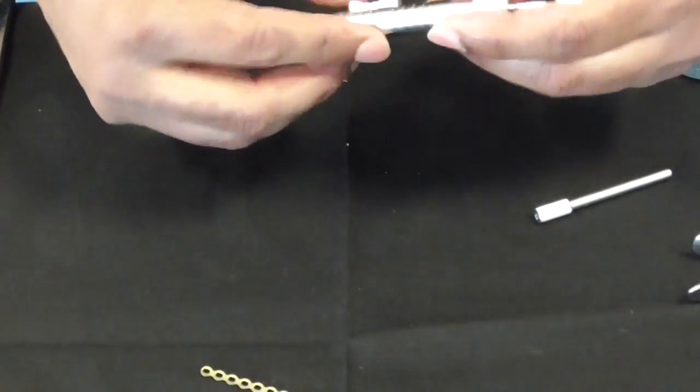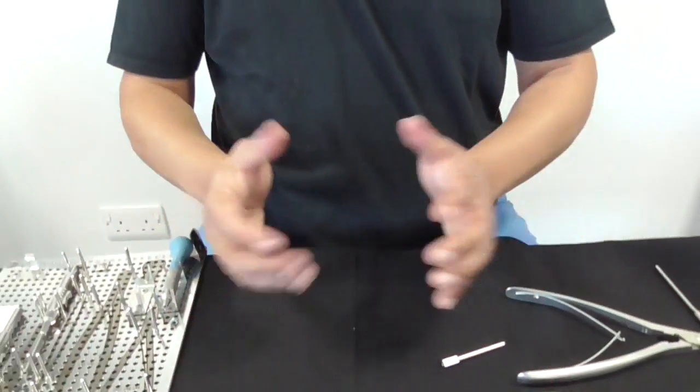That in essence is all the different bits of kit that you need for doing an open reduction internal fixation of hand fracture. Thank you very much.